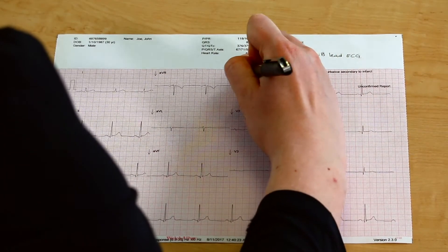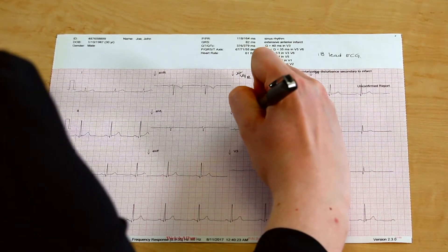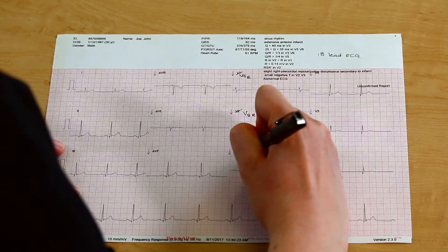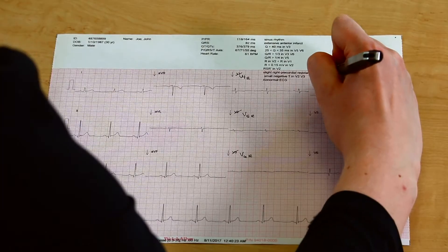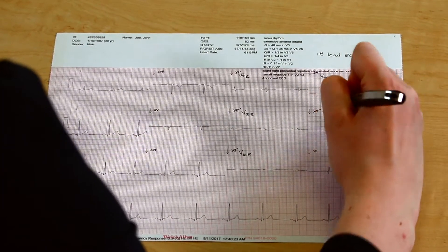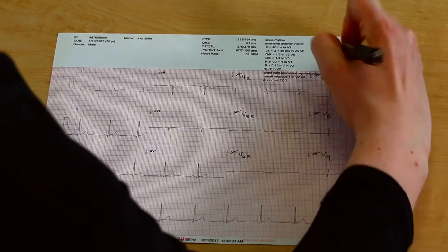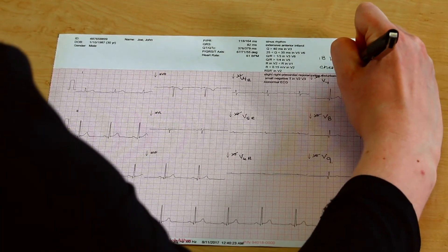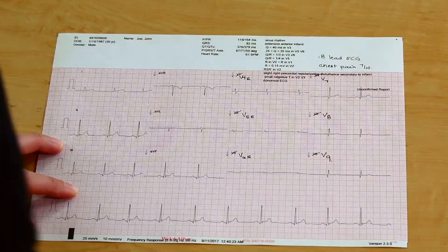On the paper, label the lead changes: V1 becomes V4R, V2 becomes V5R, V3 becomes V6R, V4 becomes V7, V5 becomes V8, and V6 becomes V9. If the patient was experiencing any chest pain during the ECG, document this on top of the tracing.